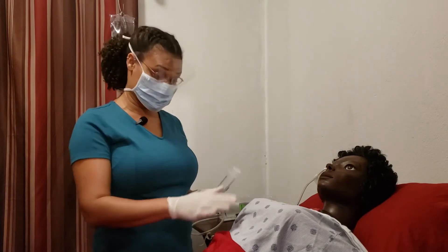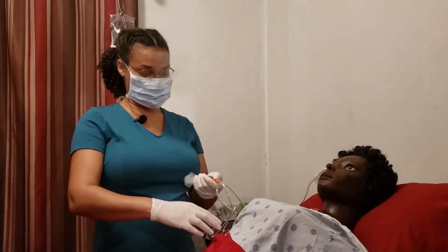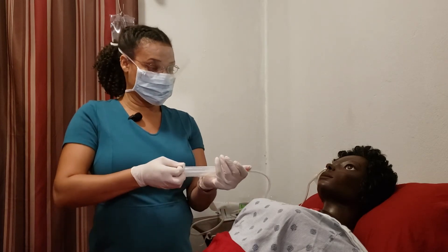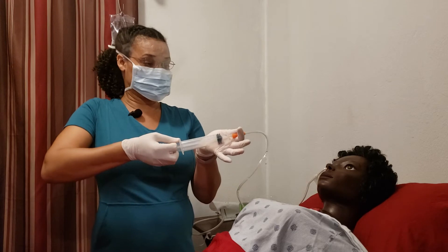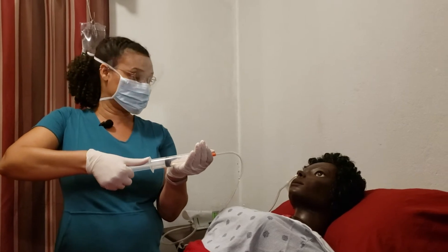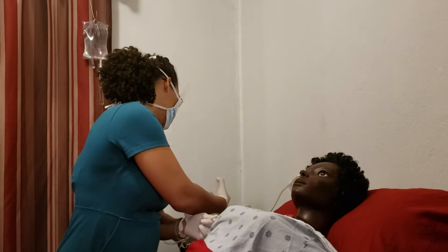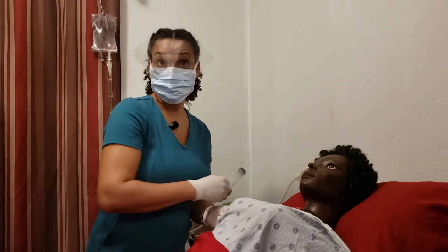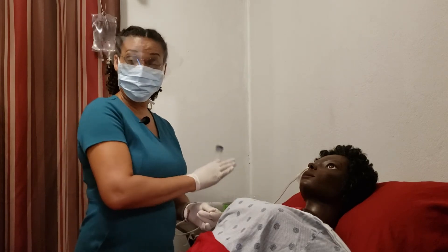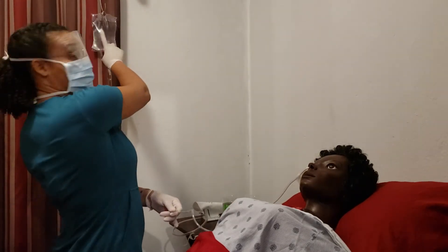After you've already checked that the placement is correct, you are going to attach your syringe and aspirate the content of the stomach. You would then gently and firmly withdraw the contents. Once you get all that content up, you will make sure that you put it aside and measure it. Now that you've established a starting point — this is what we have aspirated — you will then attach your warm solution.